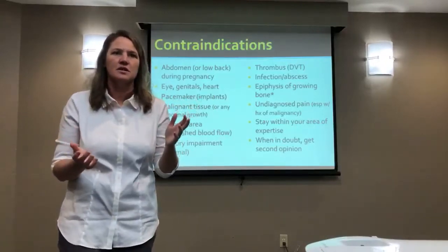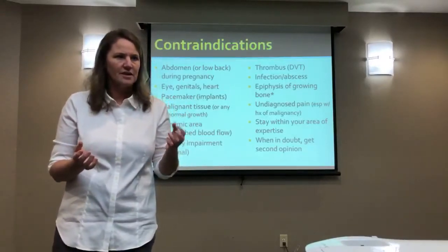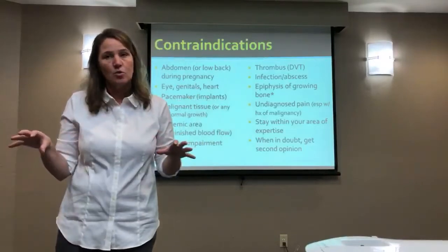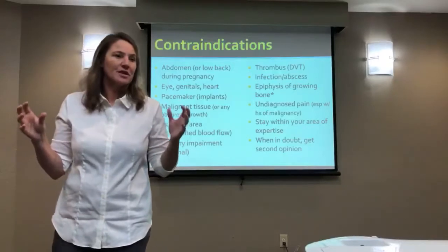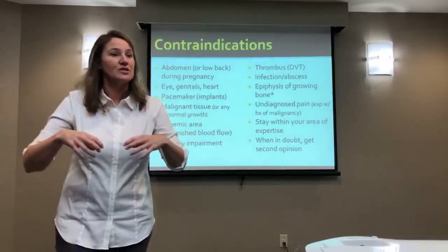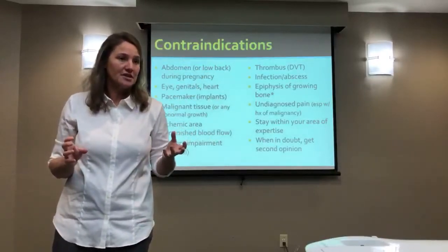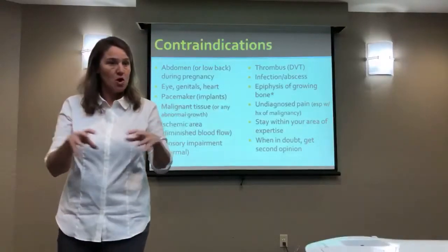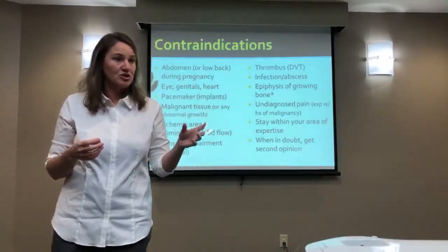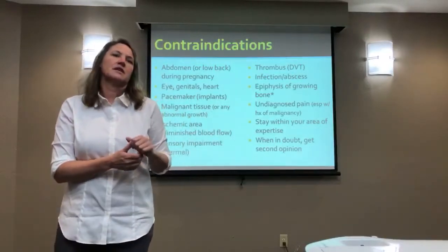As a matter of fact, I'm trying to think how many years ago it was that they did the debate at the national conferences. I can't think what it's called, but they have the round table and they have the two teams. They actually argued back and forth whether we should keep our modalities or not. I can't remember the exact terminology they used for the debate, but they put ultrasound and stim together, which I thought was wrong, because there's such a huge difference in the amount of research to show these things. But they combined the two, and in the end, they argued their case. So even in that, they had various research that they presented as to why, yes, we should use these modalities and they should be reimbursable and they do work, even though nobody's researching it.